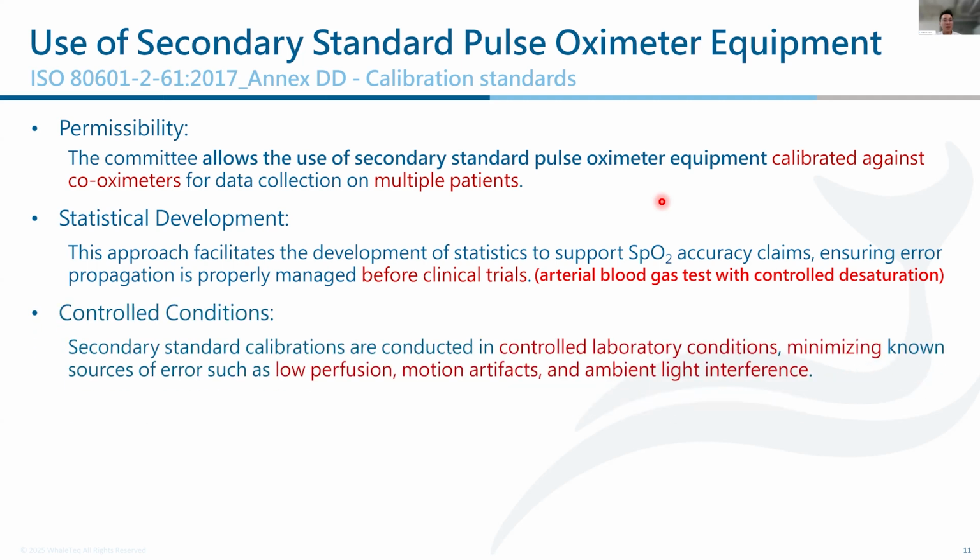And tests are going to happen in controlled laboratory conditions. In this condition, we can minimize all the sources of known error, like low perfusion, motion artifact, and ambient light. In the 510K approval, they will specify if the applicant device is applicable to those kinds of situations.